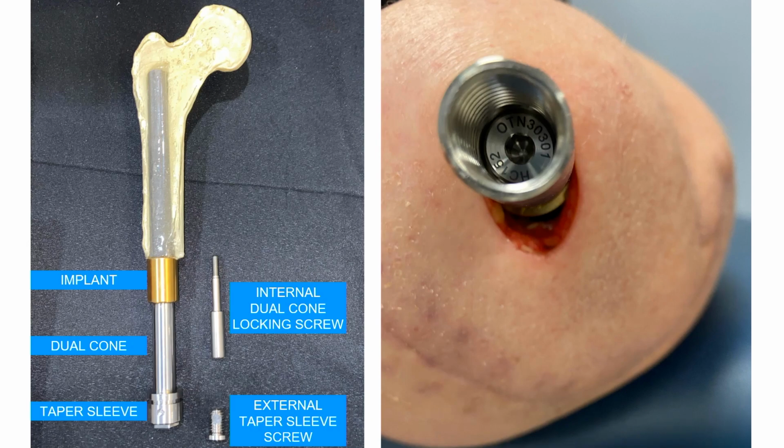And what we're seeing is these screws are loosening very soon within the first 14 months of rehab. We've been following this, and every 2 months I'm recommending you tighten these screws, and after about 14 months we see stability, and then you can tighten them every 6 months.